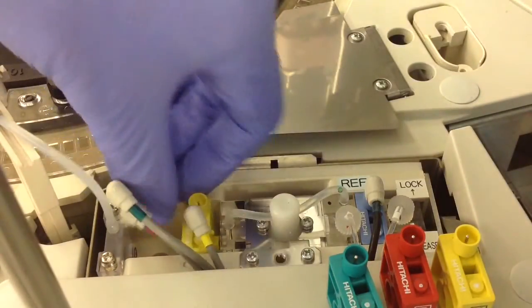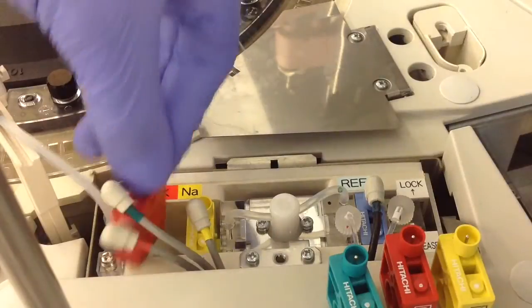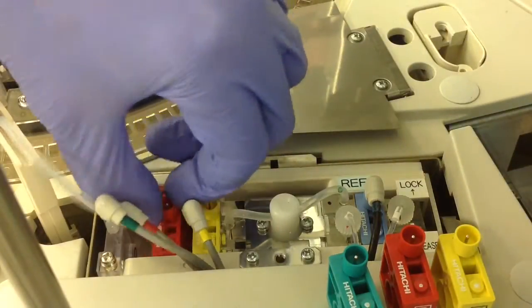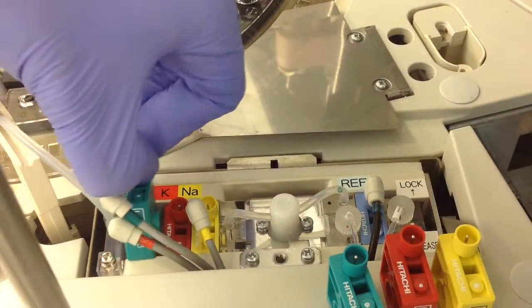In case you forget which order the cartridges go in, Roche has kindly added colored labels right above the area they go into so you know the correct order. They also added colored strips to the cables so you know which measuring cartridge each cable plugs into.